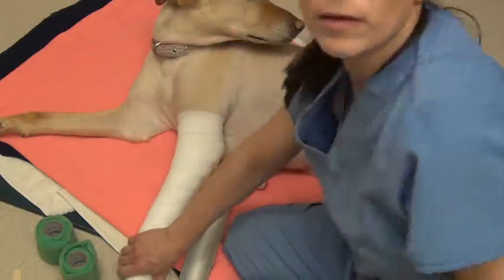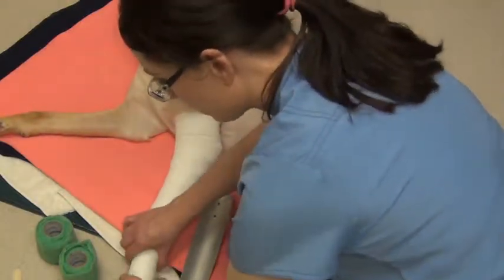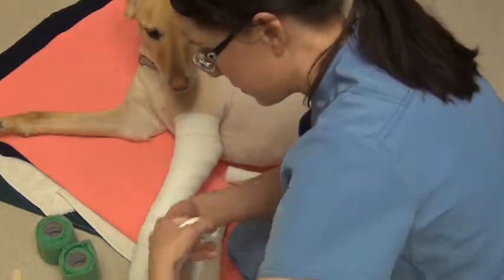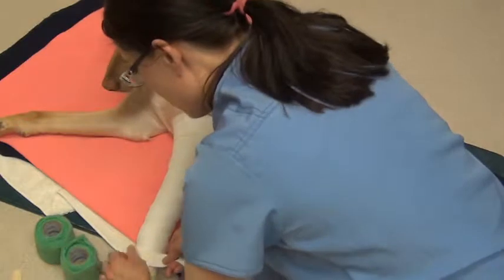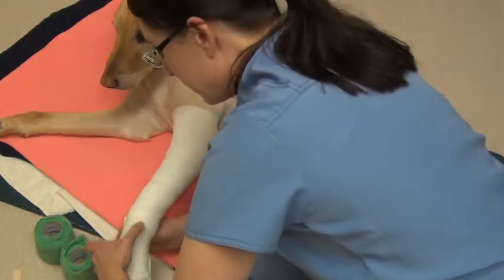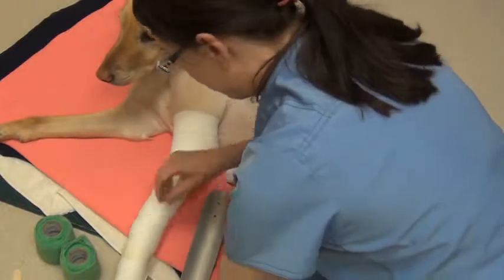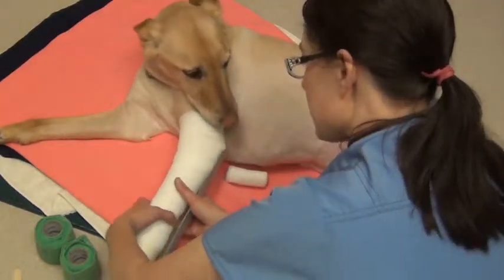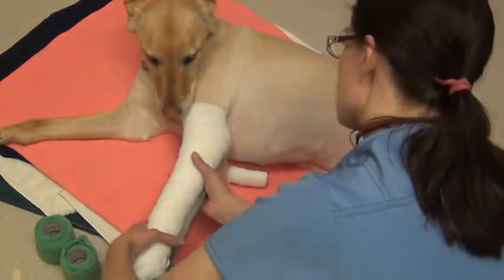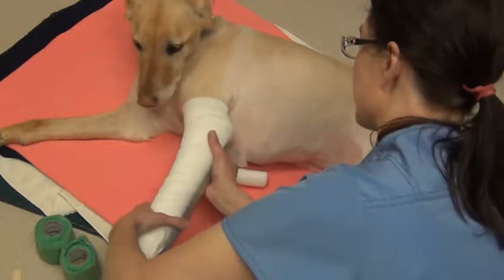This tape is not sticky at all. And I've placed an extra piece here since this tape is kind of shifting a little bit, since it's not very sticky. I'm going to place a small piece there to keep that in place. Alright, now with this splint for her, this is a little bit short for her leg. I think I'm limited on the options that I have.